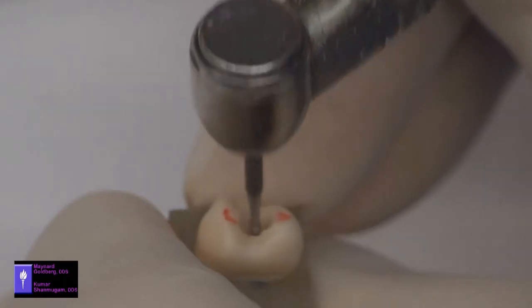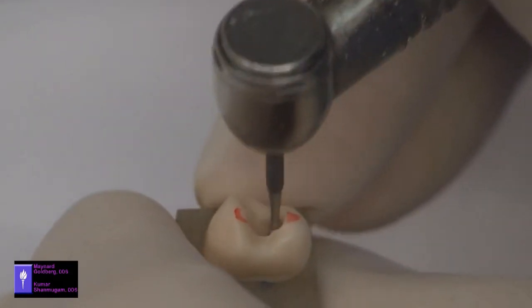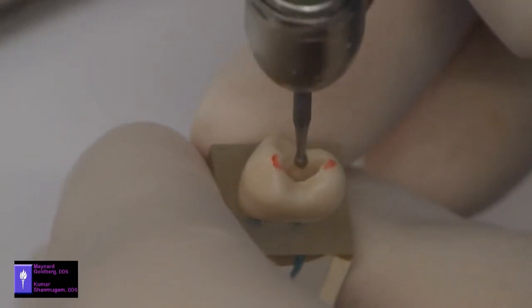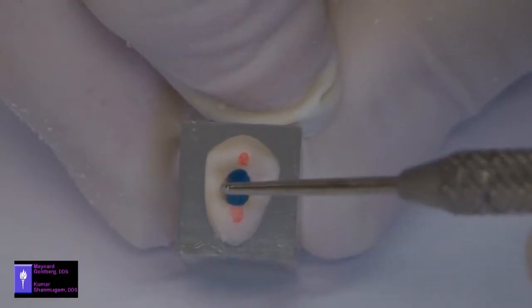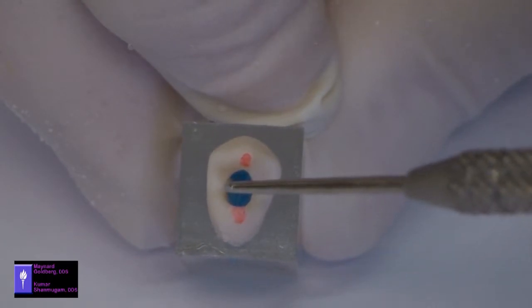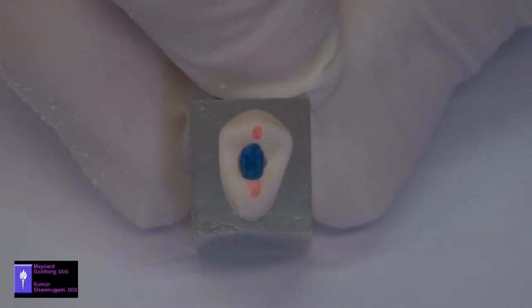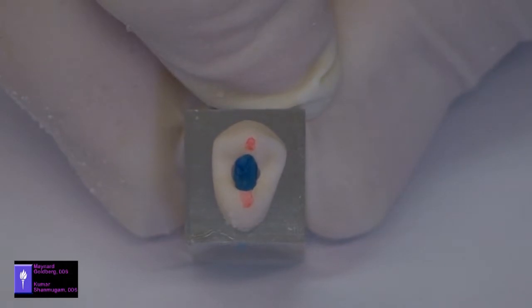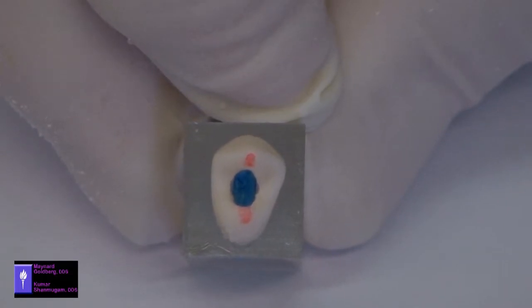Notice the position of my burr has not changed as I move it around. It's still held in the long axis. Notice you have a full view of both canals. The shape of the access cavity follows the shape of the tooth. And again, the enamel-dentin ratio has been maintained. This tooth is ready for cleaning and shaping. Also notice that the mesial and distal marginal ridges have been maintained.